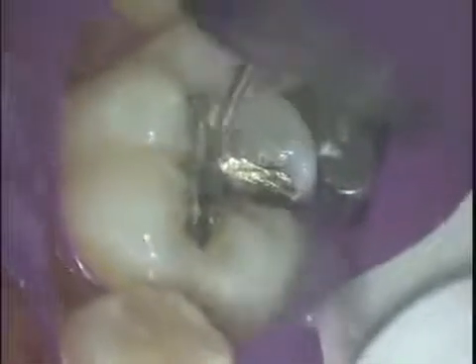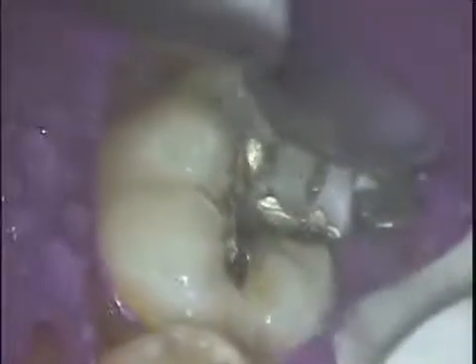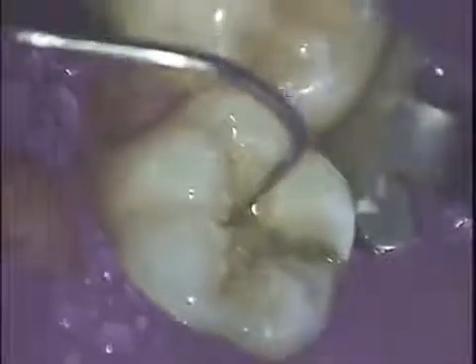In case number 2, a Class 1 cavity preparation is demonstrated. Here, an existing failing amalgam is easily removed using a high-speed burr and copious amounts of water under rubber dam isolation. The remaining amalgam is removed, followed by explorer examination of the cavity preparation.